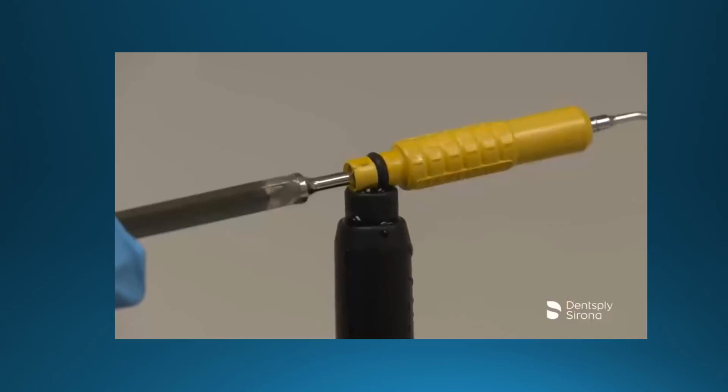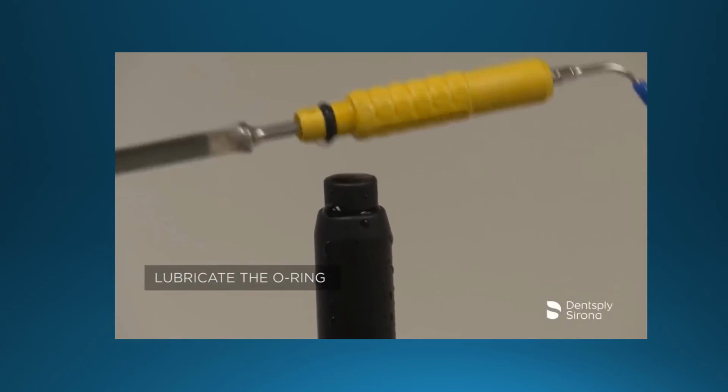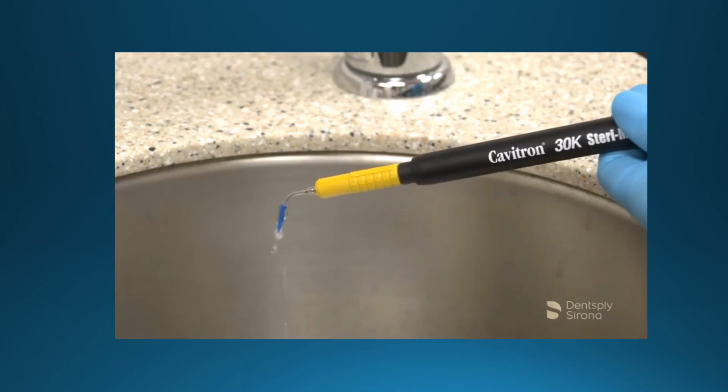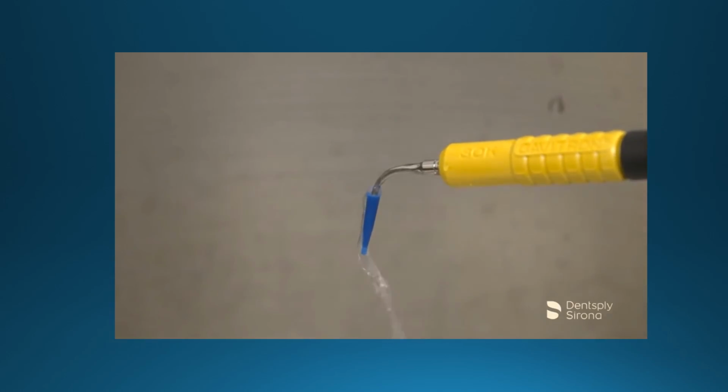After the clinician has placed the soft tip disposable prophy tip with the wrench included, filled the handpiece with water, seated the insert, selected the power, and adjusted the water flow to obtain a fine spray, instrumentation begins according to the treatment plan prescribed for the patient.